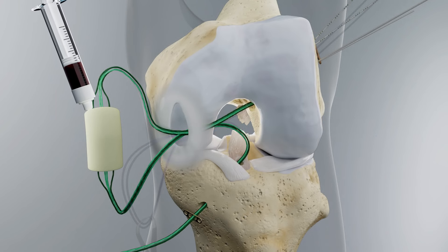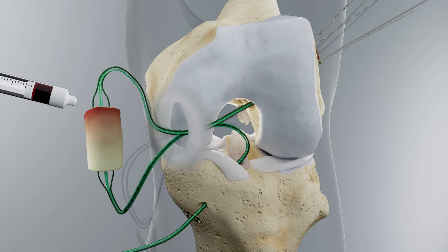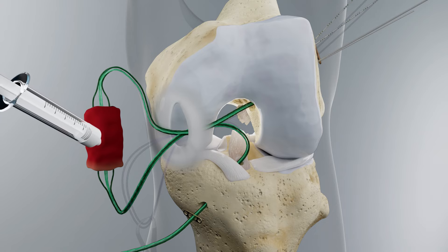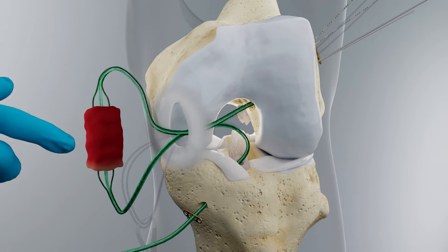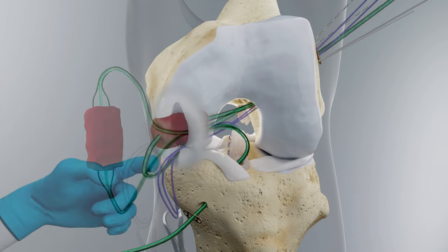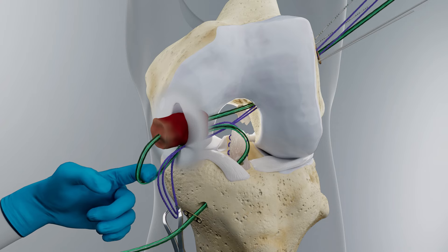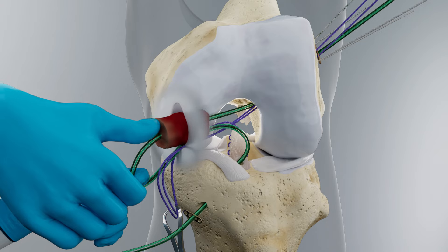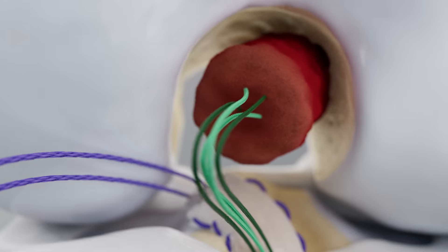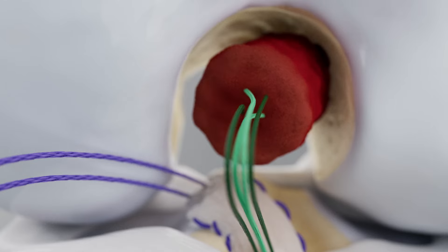Slowly apply blood to the top, proximal end of the bare implant, allowing the blood to fully penetrate. Then carefully drag the syringe down and around each side of the implant. Leave a small distal segment less saturated and slightly firm to help facilitate passing and positioning of the implant into the notch.